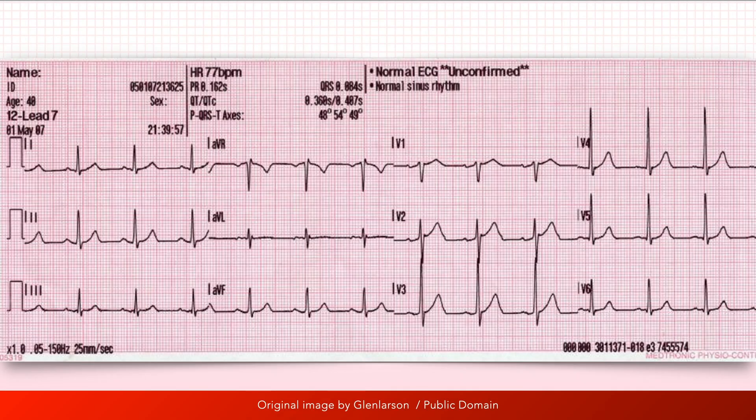The first rhythm we'll look at is a normal sinus rhythm. With a normal sinus rhythm, a QRS complex follows every single P wave, and a P wave precedes every single QRS complex. Although that may sound obvious, the two statements are not equivalent, nor does one automatically entail the other.